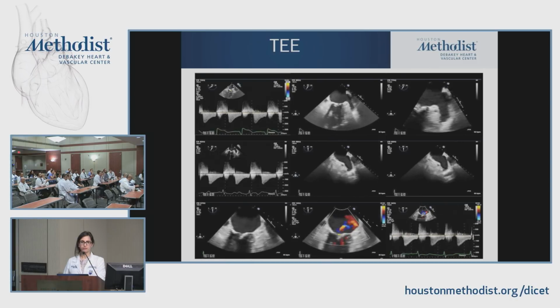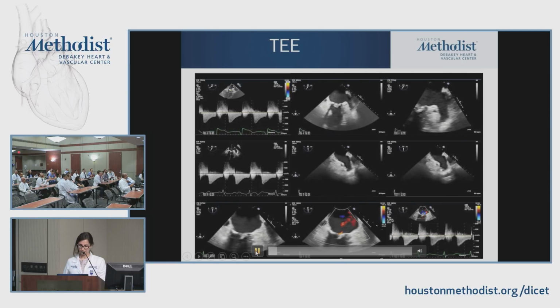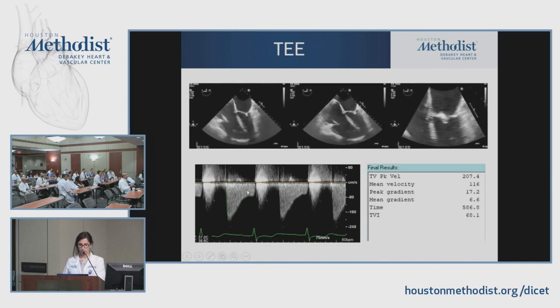Can you describe the mitral valve? Moderately thickened, appears somewhat rheumatic, and I don't see the opening as much as I want to. It's not really cooperating here either. Okay, let's do this. All right, mitral valve. Yeah, there's significant restriction of opening. I can't really comment on the commissures, though. And, you know, 3D would be helpful here.